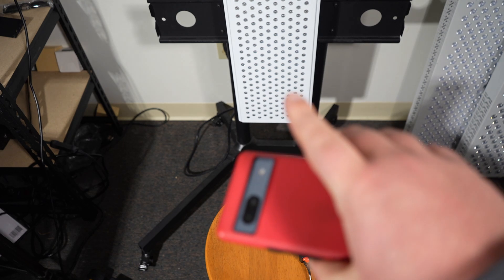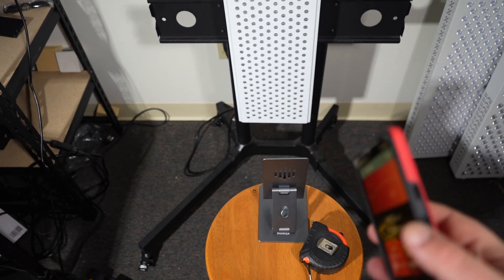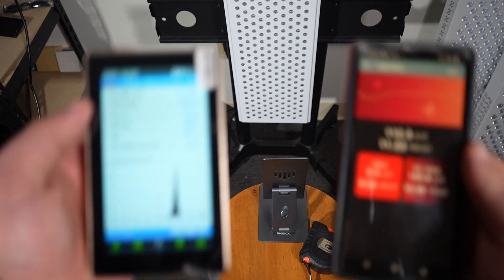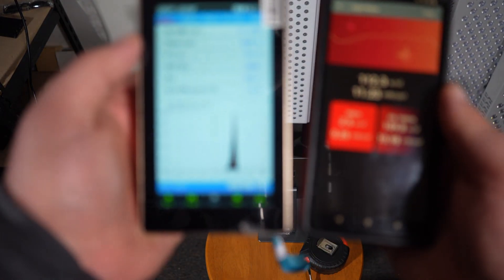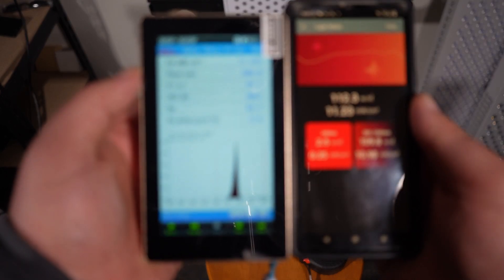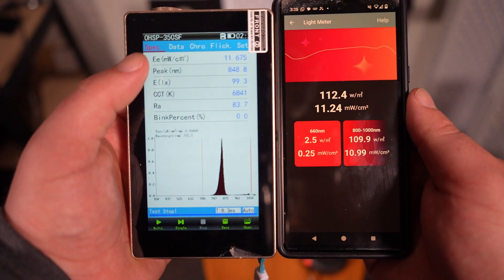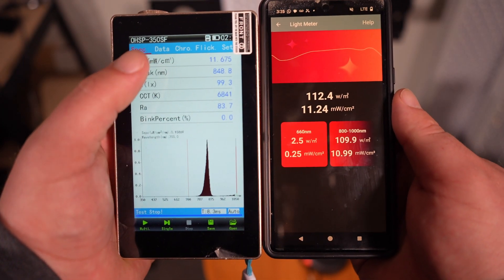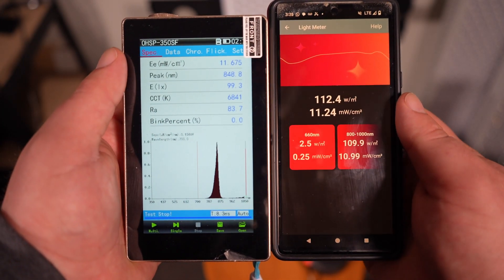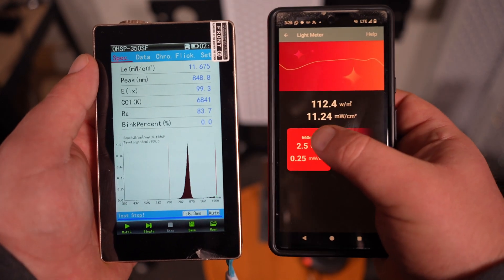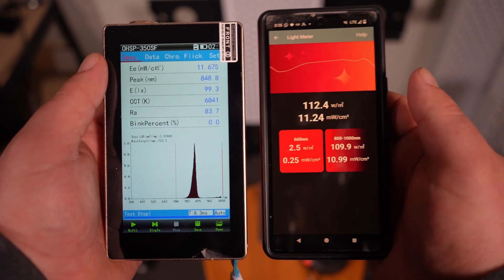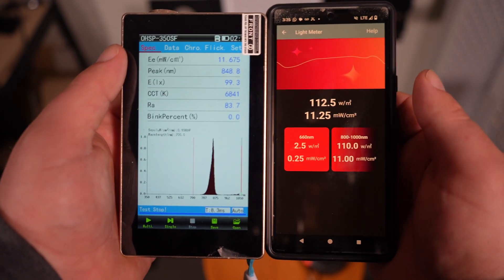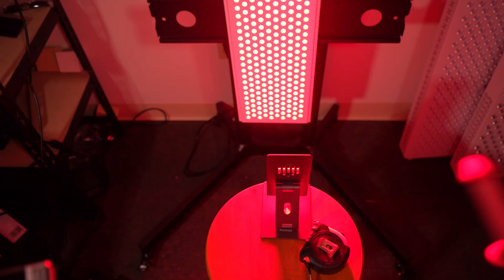Now we have the Viver panel in near infrared only. It's completely invisible, just sending the 850 wavelength. The Hopo color gets 11.6 milliwatts per centimeter squared, and the Viver sensor gets 11.2 milliwatts per centimeter squared. Again, very good matchup.